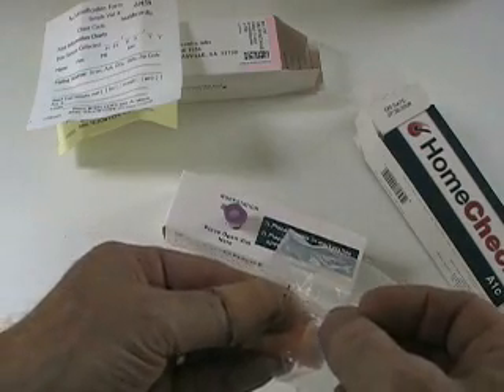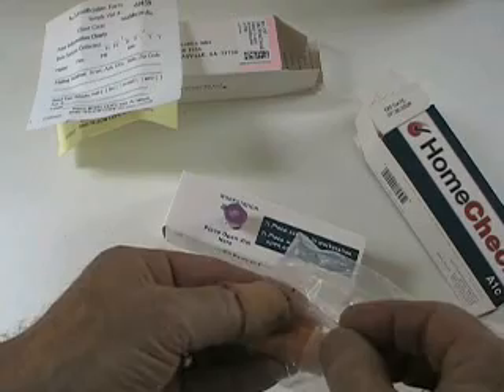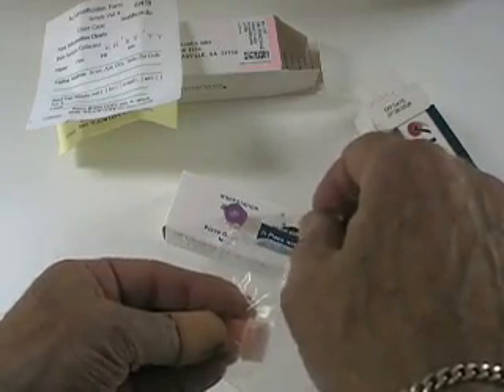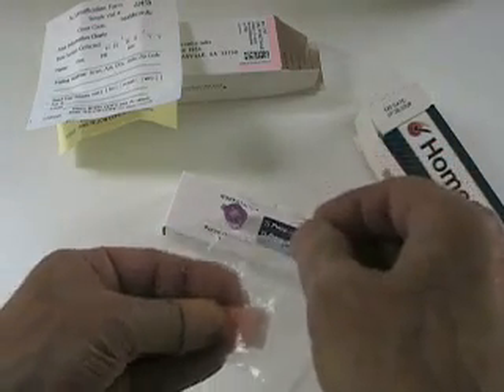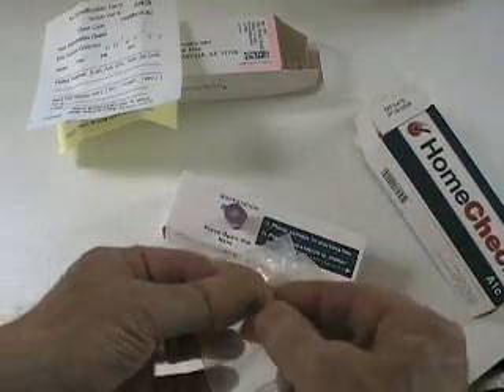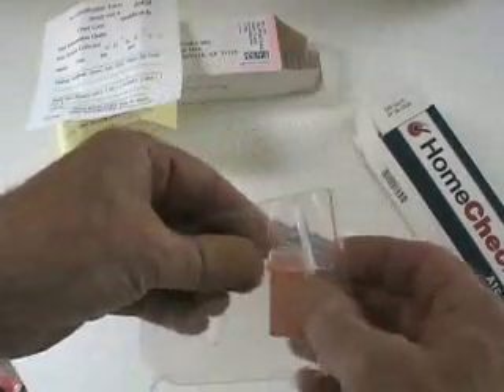You're going to suck the blood up into the capillary tube. When it's filled up to the line, hold it over the open vial and squeeze the bulb. It's important not to squeeze the bulb while you're getting the blood sample — squeeze it after it's been filled up to the line, then deposit it into the workstation vial. It also comes with this little lancet device.